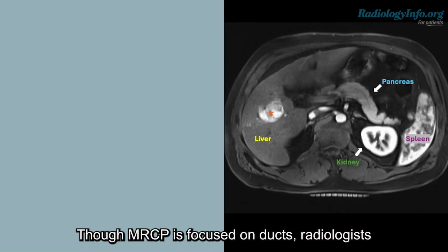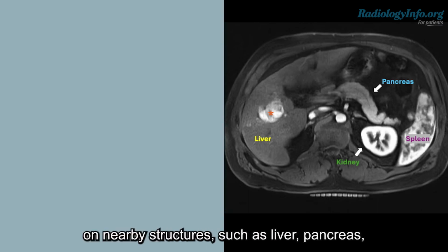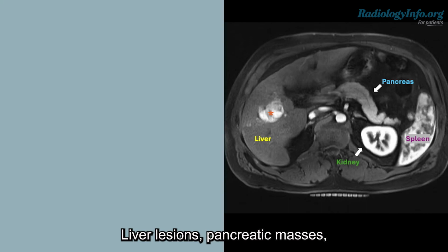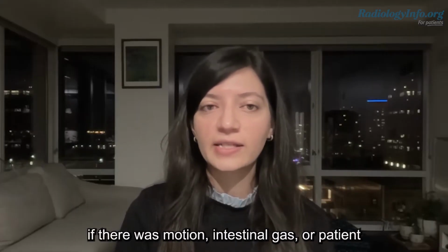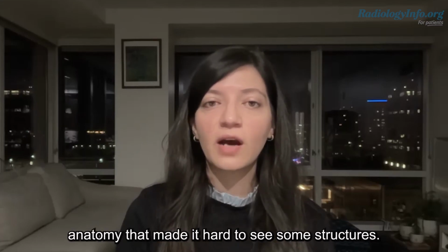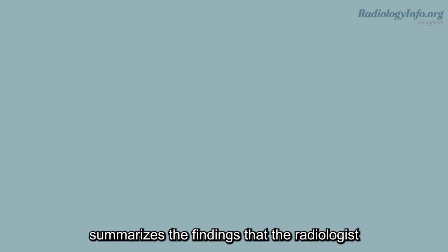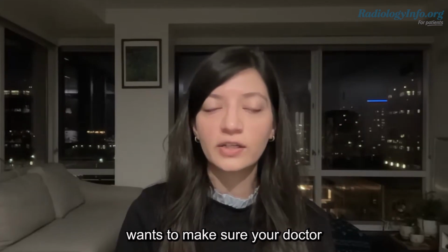Though MRCP is focused on ducts, radiologists may comment on nearby structures such as the liver, pancreas, and duodenum, which is the first part of the small intestine. Liver lesions, pancreatic masses, or signs of inflammation or buildup of fat in the liver may also be included here. The report may also note if there was motion, intestinal gas, or patient anatomy that made it hard to see some structures.